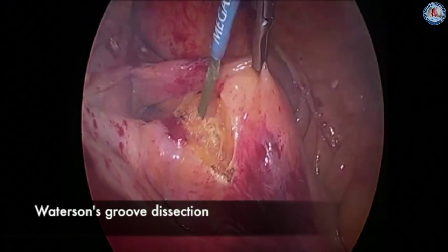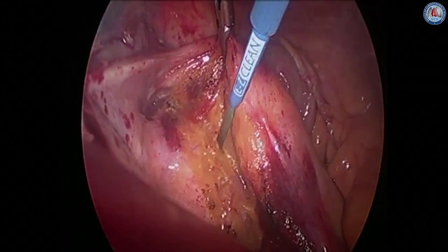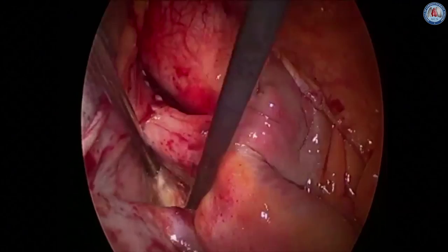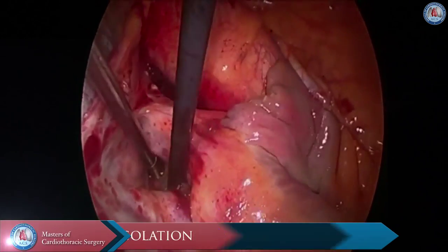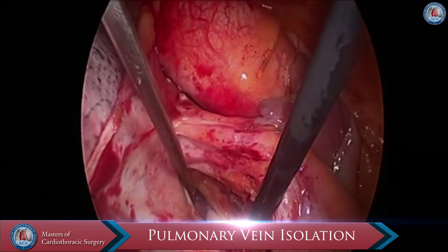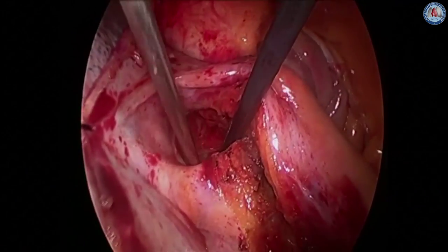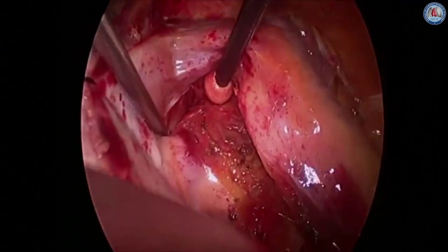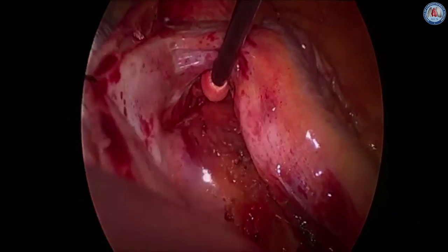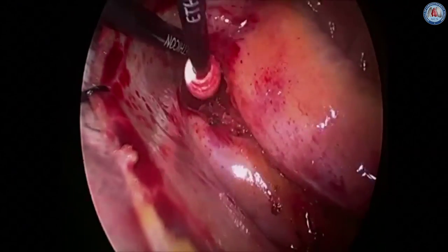We usually use a five millimeter 30 degree scope. The interatrial septum is then dissected in order to mobilize the groove and allow for adequate pulmonary vein isolation. The space between the right superior pulmonary vein and the right pulmonary artery is then dissected down into the posterior pericardium. The pericardium is entered and that space is fully developed. A clamp is then used to place an umbilical tape around the right pulmonary veins.